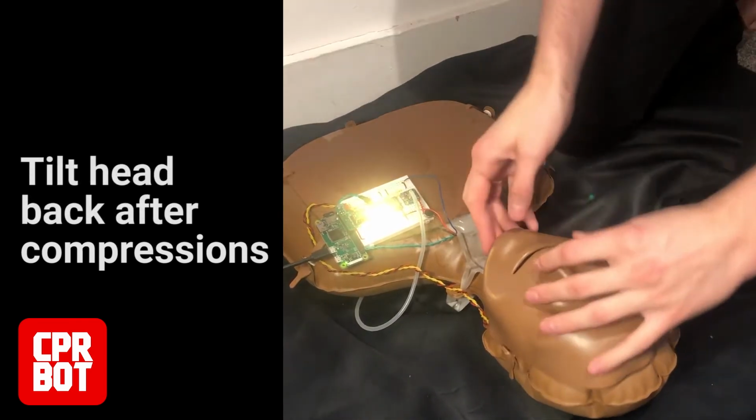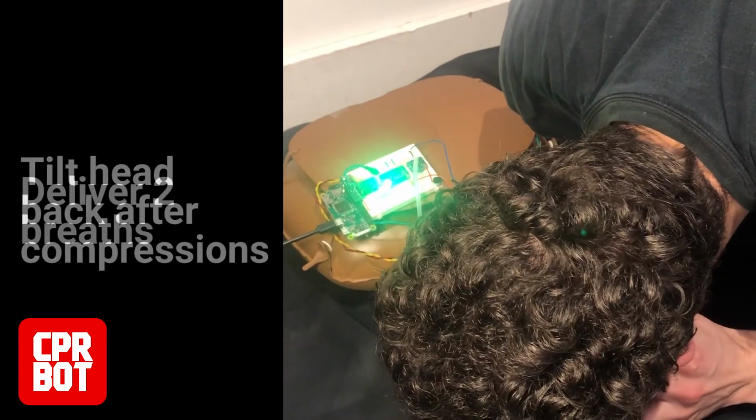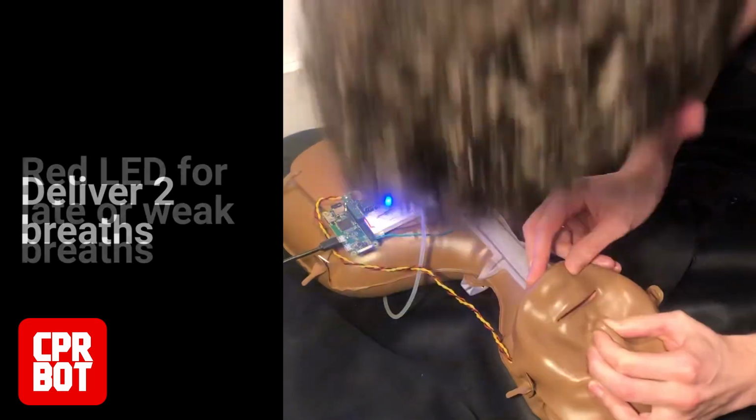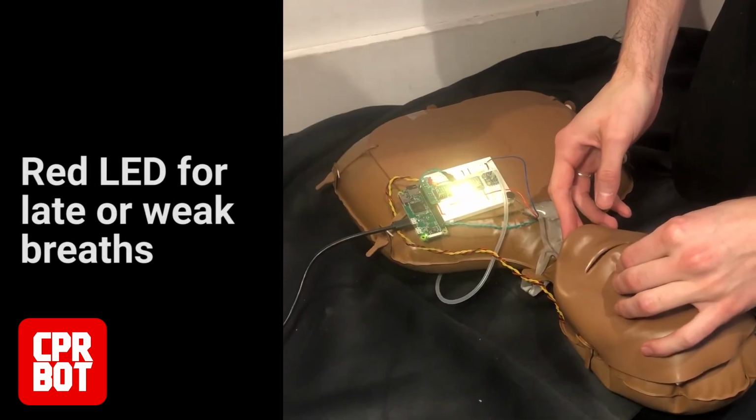After 30 compressions, the head is tilted back to open the trachea and 2 breaths are given. If the breaths don't come quickly enough or are too weak, a red light shows.